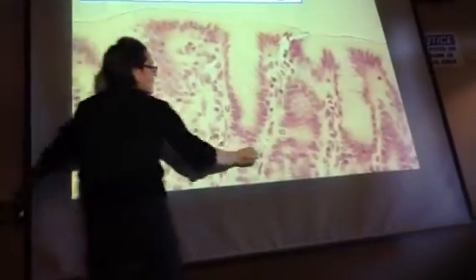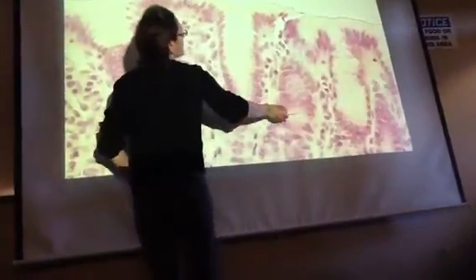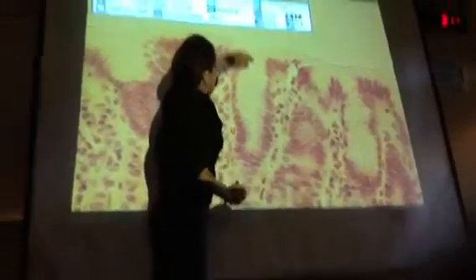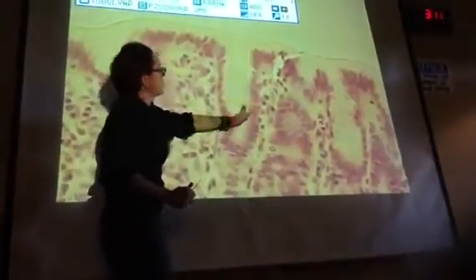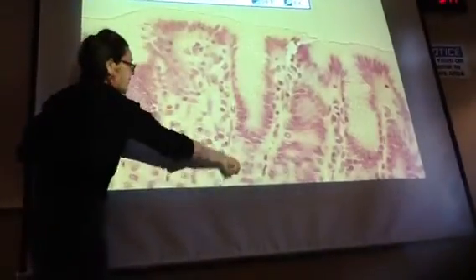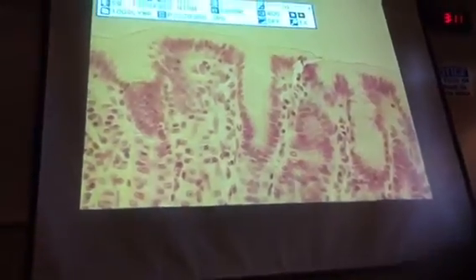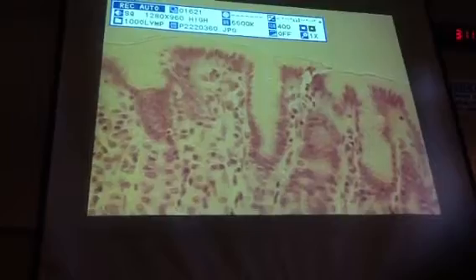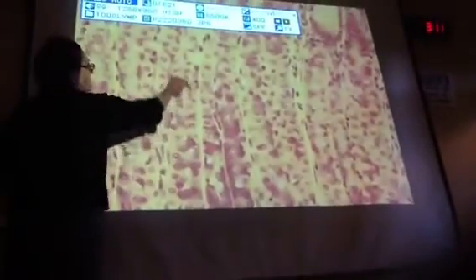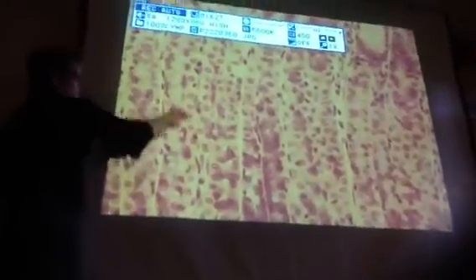This is where the nuclei are. And it's just going around like this. This is the apical surface of the cell. And this is the pit. Down underneath here, this is where your gastric glands are going to be. So if I just move this up a little bit, all of these elliptical areas of cells, these are your gastric glands.